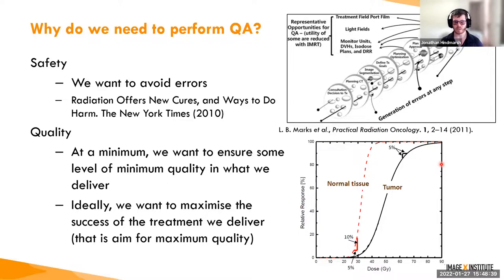Now there always is radiation and we're treating through the patient. So there's always going to be effects, but we'd want to minimize them as much as possible.